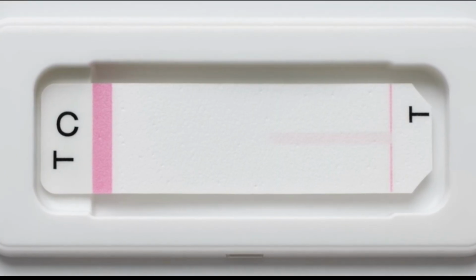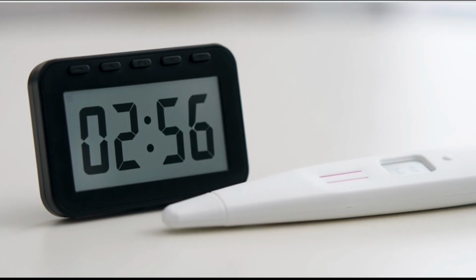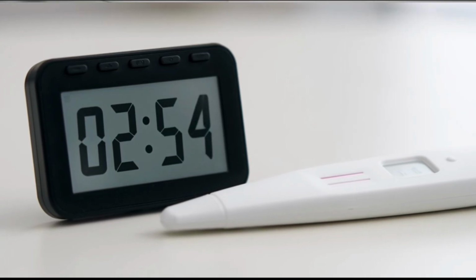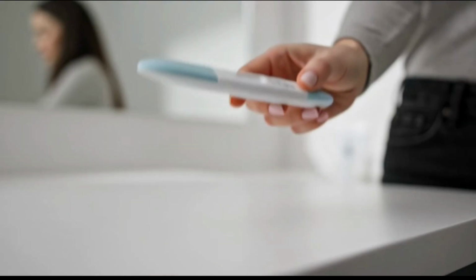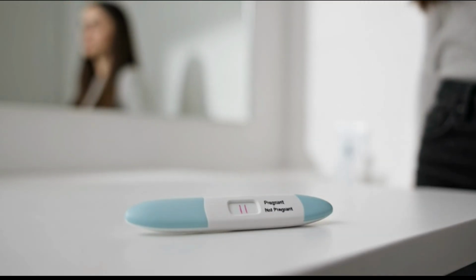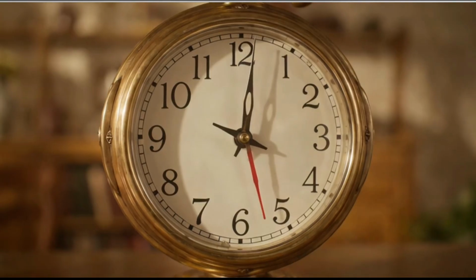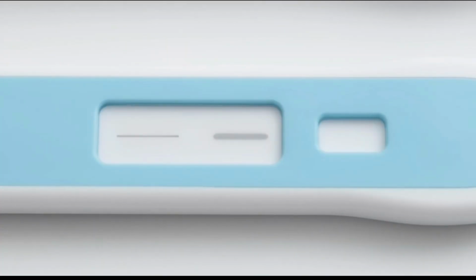But, and this is important, a faint line should appear within the test's instructed time window. Usually that's between 3 and 10 minutes, depending on the brand. Here's the part most people misunderstand. If you check the test after 15, 20, or 30 minutes, the result may no longer be reliable.